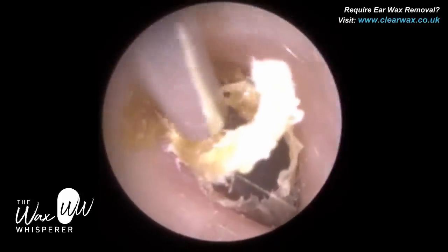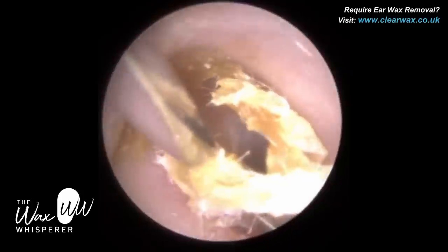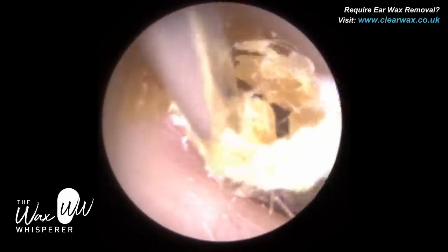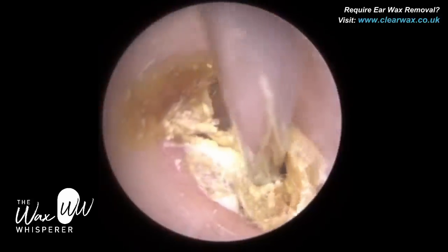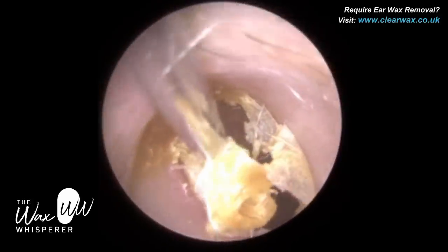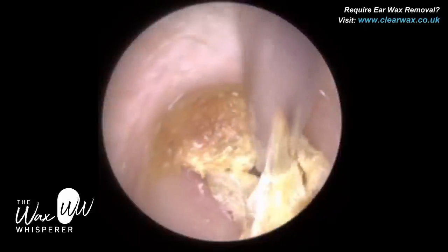They know they need their ears cleaned and the dead skin removed when their hearing aid starts whistling. You may have sat beside someone on a bus who wears a hearing aid and their hearing aid whistles.